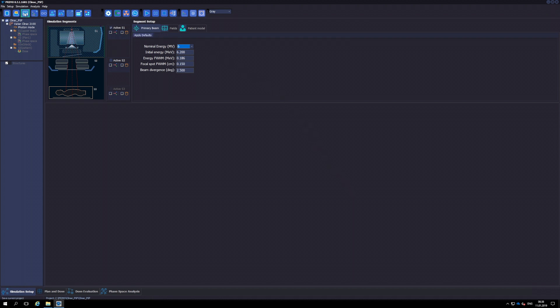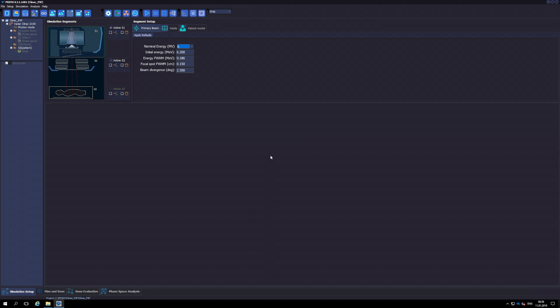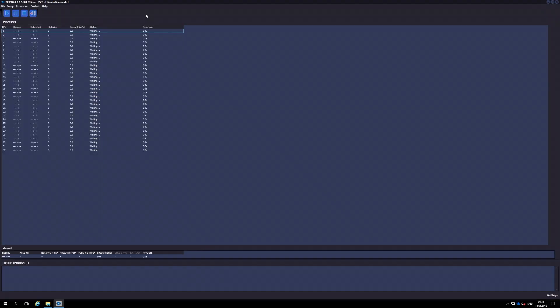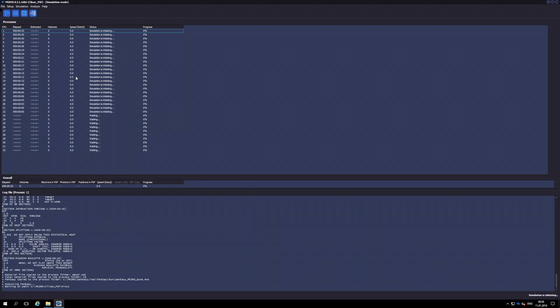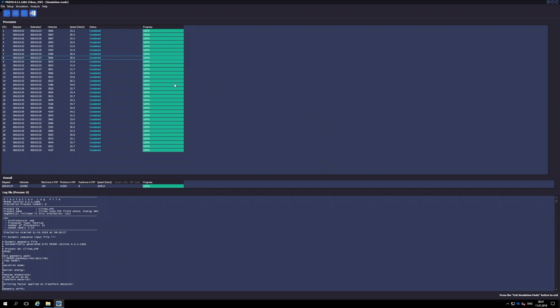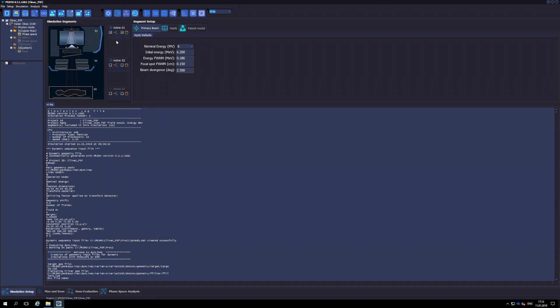Now we save the simulation and launch it. The software informs us how the processes are loaded into memory. In the lower part of the window, the log file of each processor appears. Once the simulation has finalized, we click the exit button to return to the main Primo window. Notice the two check marks that appear next to the drawing of Segment 1. The one on the left indicates that the segment has been simulated, while the other one indicates that the phase space file has been produced.